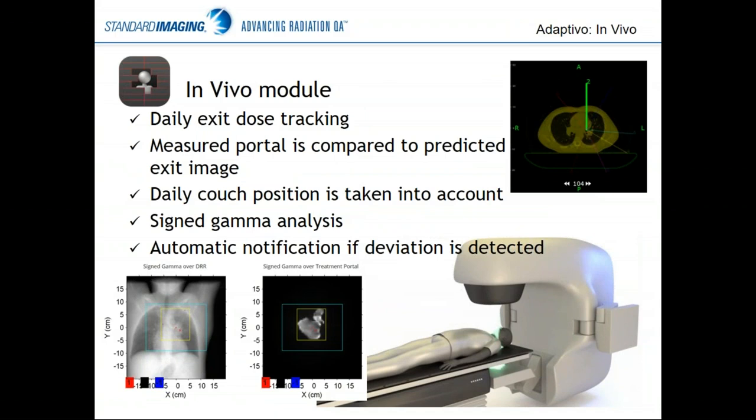The in vivo module is that exit dose monitoring — you're really tracking the beam being delivered to the patient. We compare the measured exit image with a predicted exit image, so you can see not only whether you're treating consistently, but whether you're treating the way you intended. We take the daily couch position into account, so if that's affecting the exit image, we can account for that. We also do what we call a signed gamma. Gamma by definition doesn't have a plus or minus sign — it's a value between 0 and 1 for passing, above 1 is failing. But we assign a plus or minus to failing pixels to show whether pixels are failing because they're measured hotter or colder than predicted.